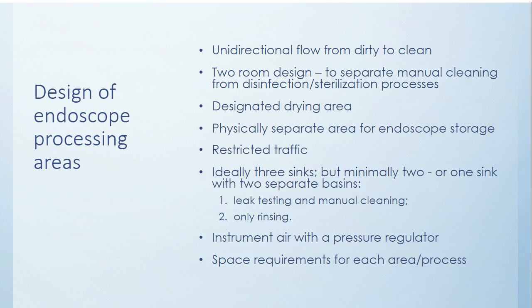If you look at the MAUDE database and the latest things that have come out from the FDA about processing of endoscopes, moving to duodenoscopes with single-use design or single-use caps, and what the true rate of culture positives is for processed duodenoscopes, we see that we still have a problem. Although we see pushback from some organizations on adding in these quality steps, it is adding in quality. It is mitigating safety issues for our patients.